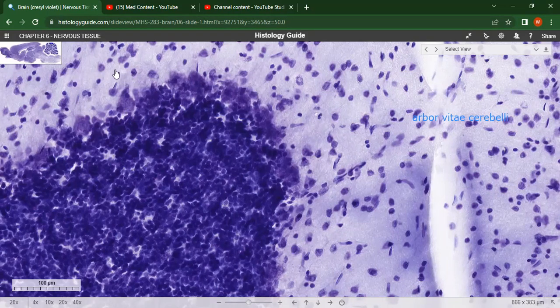So they send their dendrites into the molecular layer, where they synapse with the climbing fibers. They will also synapse with the axons from the granule cells. We will look at that. Then they send their axons into the intracerebellar nuclei, the 4 of them. I've forgotten one, sorry for that.